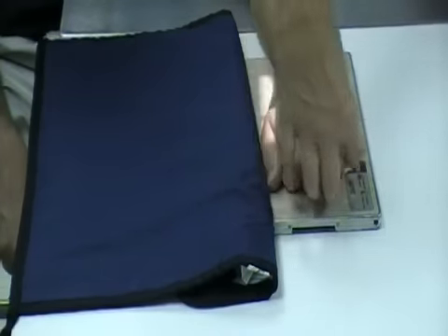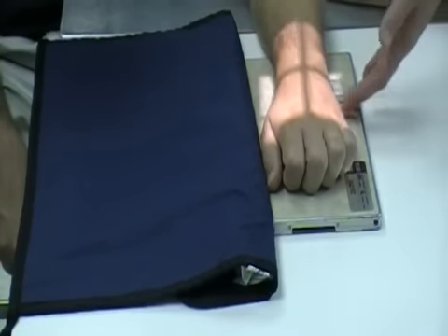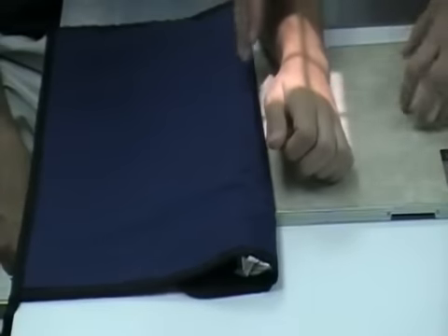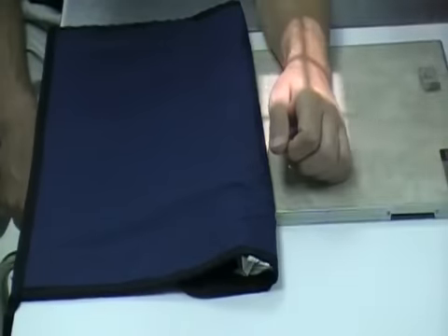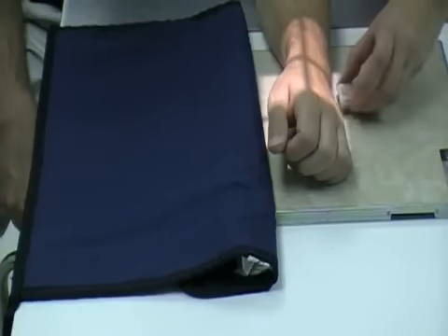Be sure the fingers are tucked under, because this does bring the wrist down closer to the image receptor, and you can see the joint spaces a little better. This is our PA, and then we're going to the PA oblique, where you just turn the hand up approximately 45 degrees. Central ray is going to be right at the carpal bones.